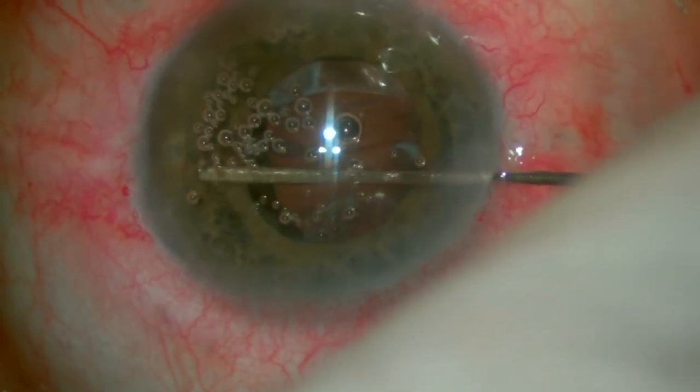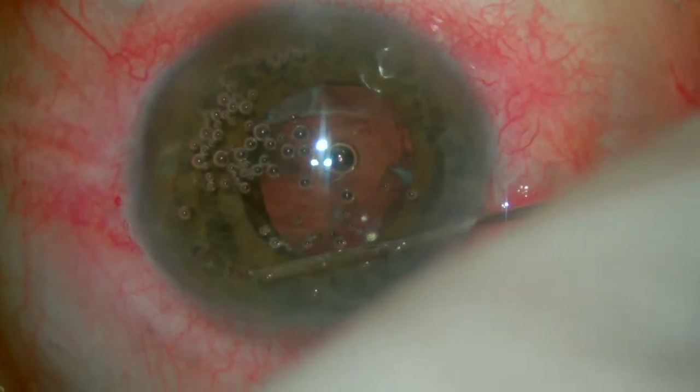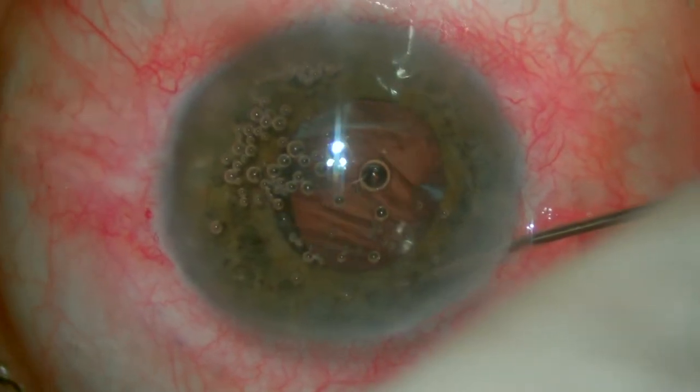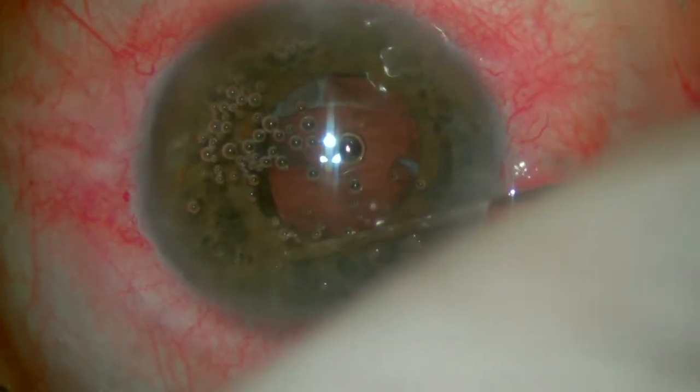Using a blunt cannula, we sweep left and right, gently stroking the iris with some miotic agent. As the pupil comes down, it helps us in judging if there's still any prolapsed vitreous, which usually causes the iris to be peaked where the strands are present.